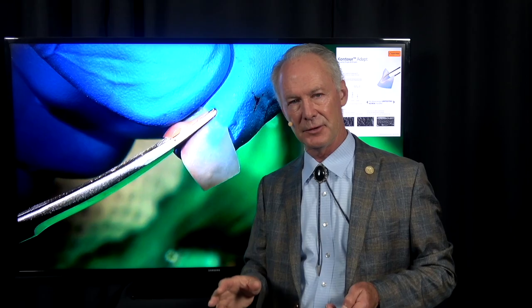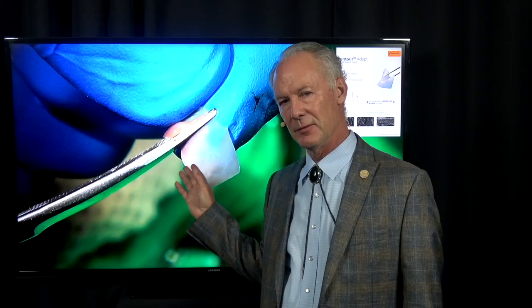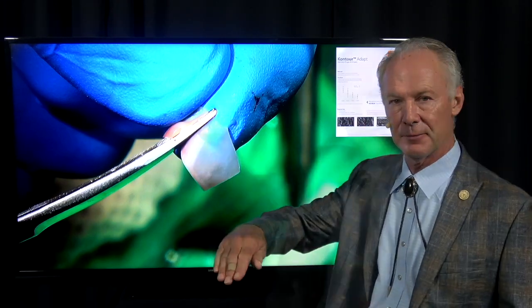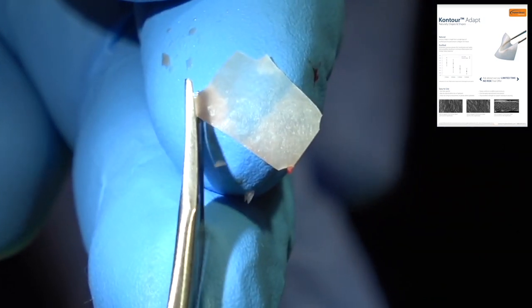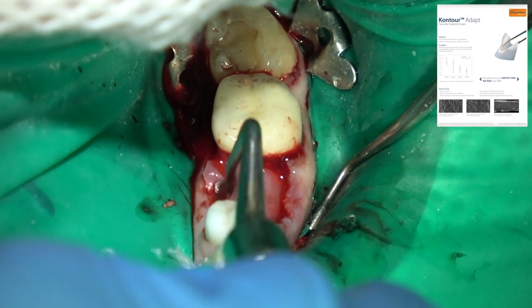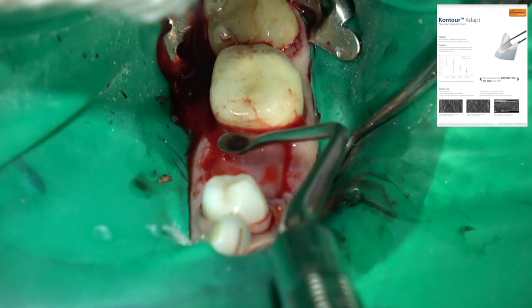Now this is a resorbable collagen membrane. The reason you place it over the graft is to isolate the graft from the soft tissue. Soft tissue grows faster than bone, so the resorbable collagen membrane gives the bone about a three-month head start on the soft tissue. You don't want the socket to fill with soft tissue — you want it to fill with bone, so the patient's own bone replaces the artificial bone in the socket. We tuck the membrane under the flap on the facial and lingual. The flap is still connected in keratinized gingiva, just reflected a bit so I can tuck the membrane underneath it.